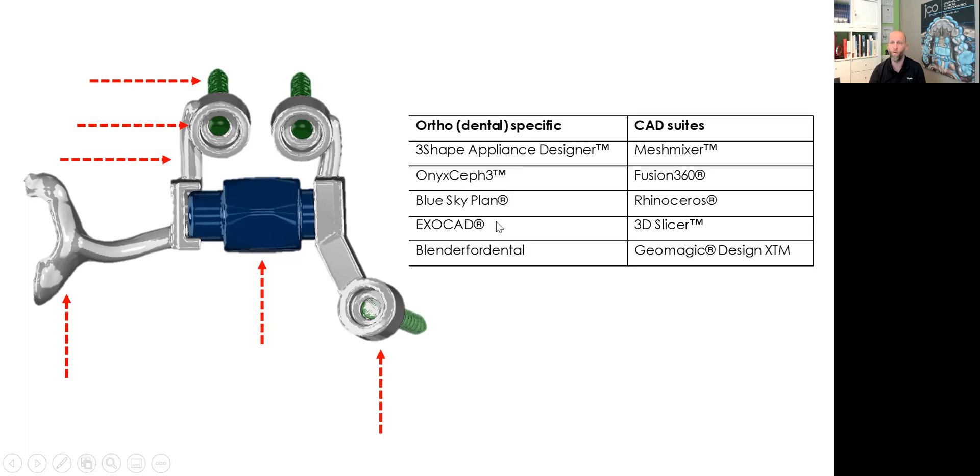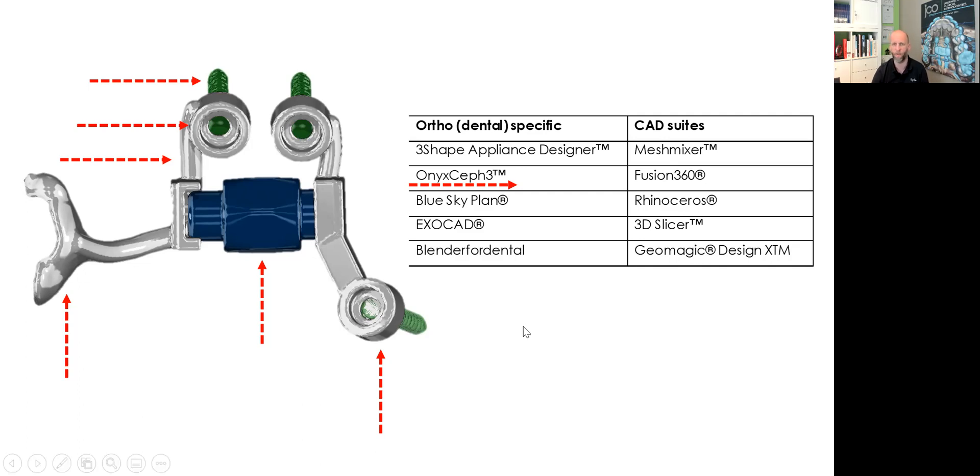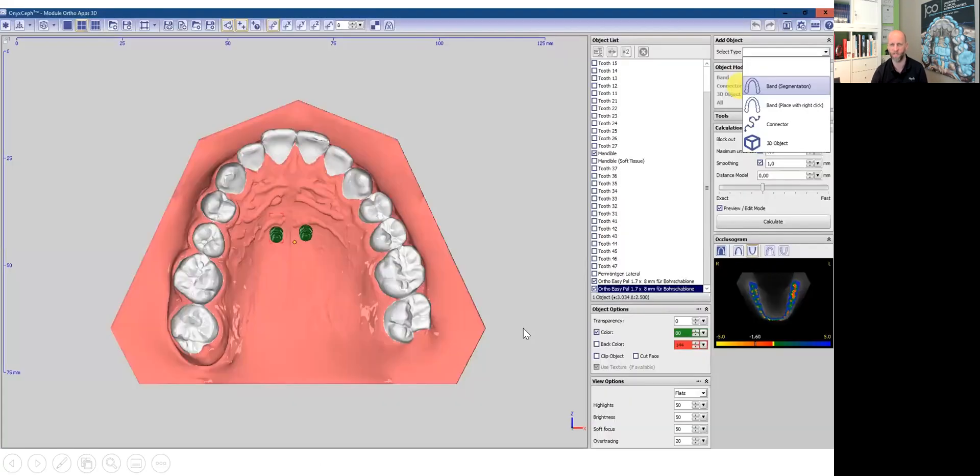To perform that digitally on your laptop, you need a software. In my short video, I use a software called OnyxCeph. Most software have similar functions, but I have to choose one and it's OnyxCeph. When we start, the screws are already placed.